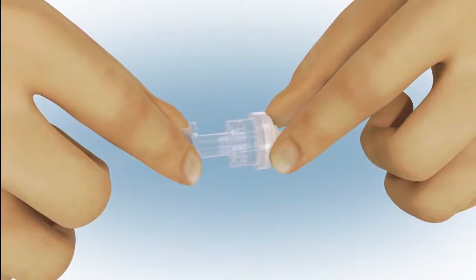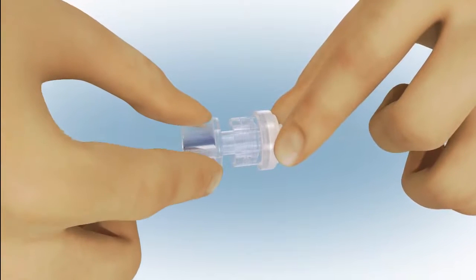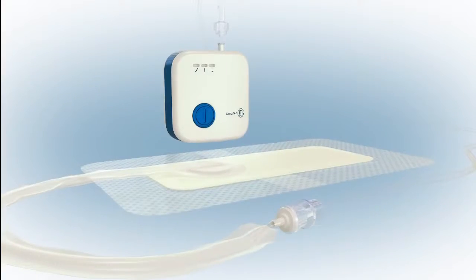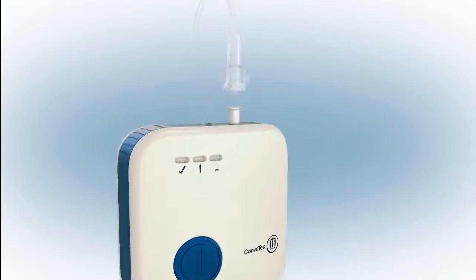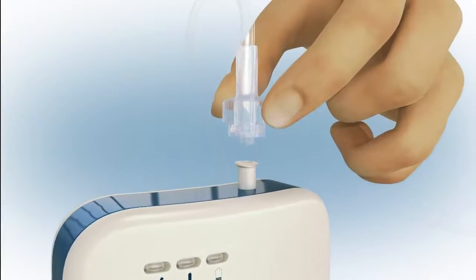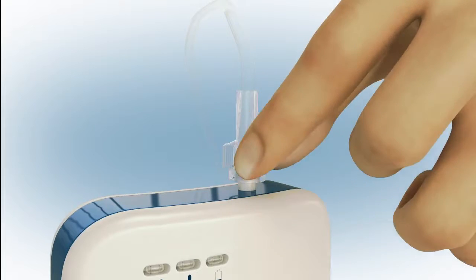You'll need to twist together the connectors to ensure a secure connection between the dressing and pump tubing. If a shorter connection is required, the pump tubing can easily be removed from the pump, and the dressing connected directly to the pump.